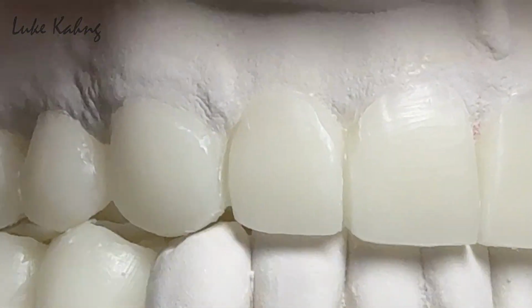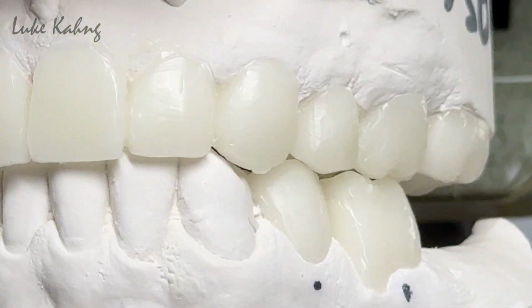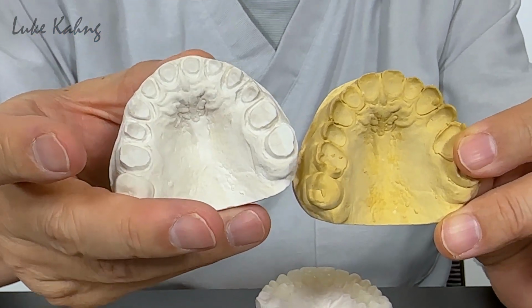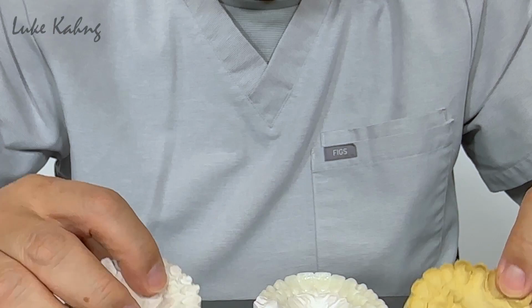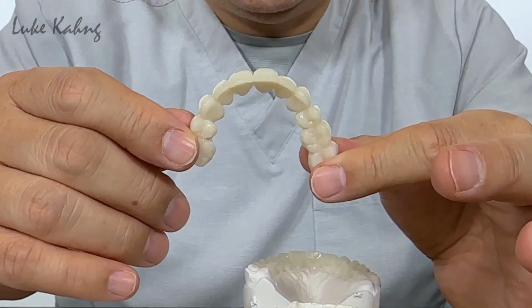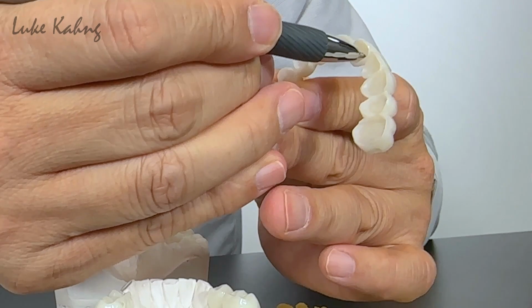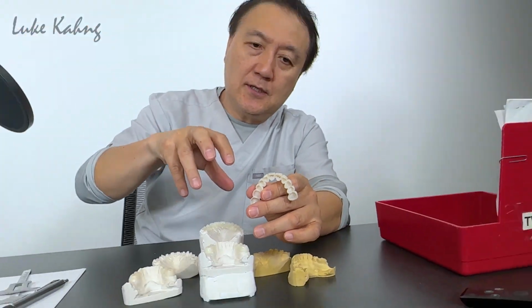concave. Maybe they need some composite. Okay, so that one is another canine rise concept. So the doctor is going to put some composite on top of that. They are going to utilize our temporizations, which we did, and then they can do a reline. So my job, I have to grind more here, quite a bit, and then make more shell types.